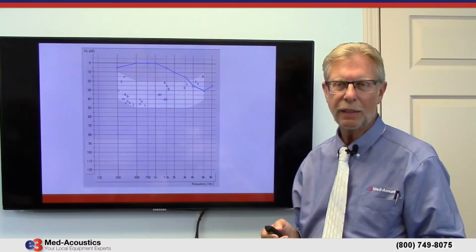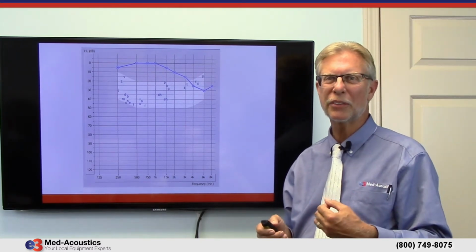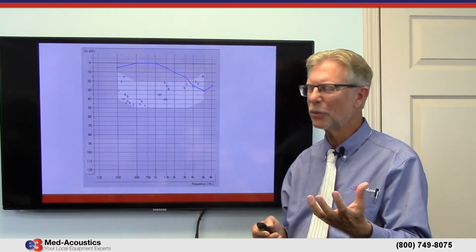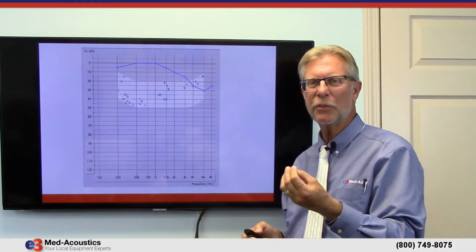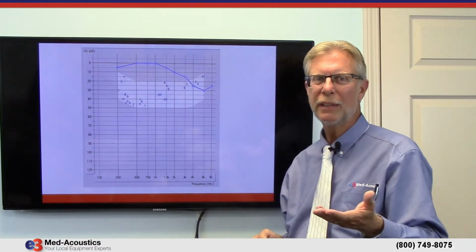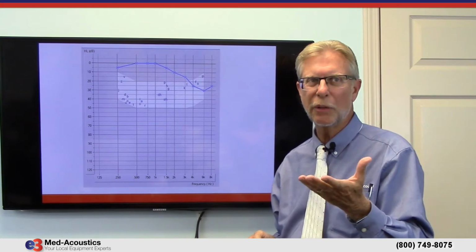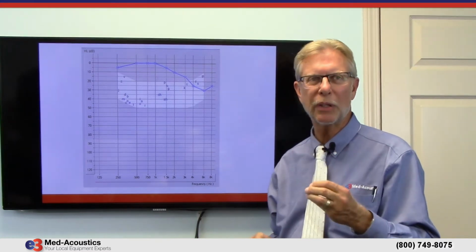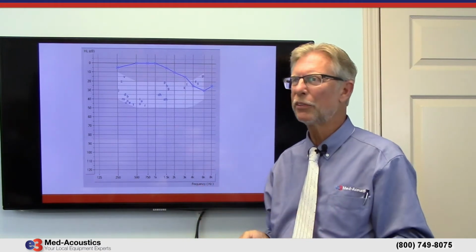Oh, and by the way, I don't have perfect hearing. I have a mild sensorineural hearing loss. So you can do this test if we do it properly, taking into consideration all the things we're going to talk about, with patients that have a mild high-frequency sensorineural hearing loss, which many of them will. However, as we'll see shortly, when there's a sensorineural hearing loss that's too great, then we're not going to be able to do it like this. We're going to have to go to a TM electrode in order to be able to test patients with a greater degree of sensorineural hearing loss.